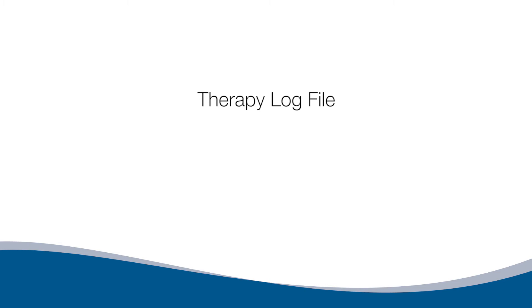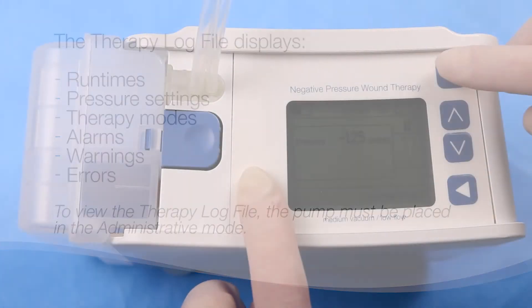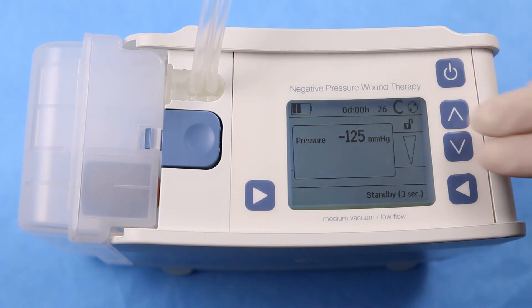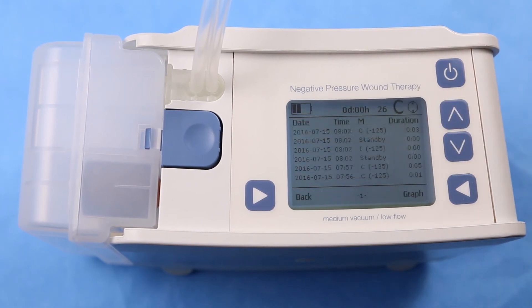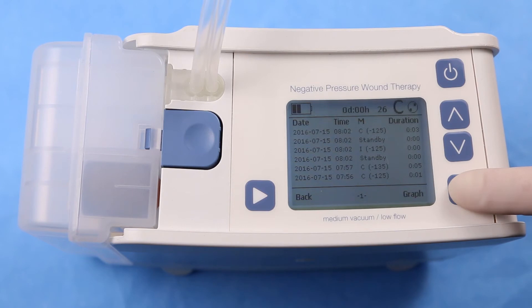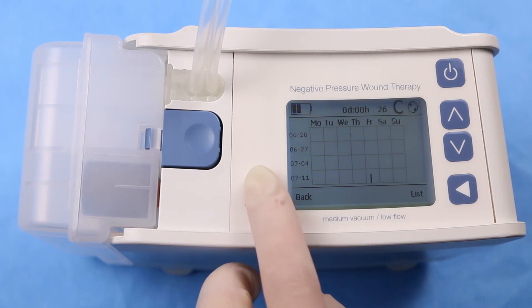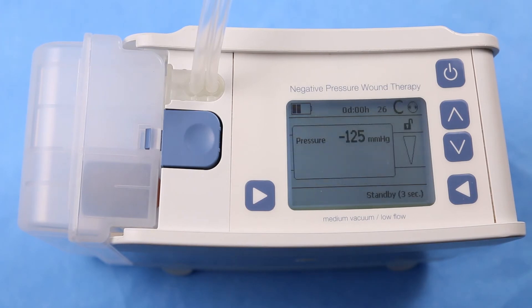Therapy Log File. The Therapy Log File displays run times, pressure settings, therapy modes, alarms, warnings, and errors. To view the log, the pump must be in Administrative Mode. Press and hold the bottom left button and then press the top right button, then press the up and down arrow buttons at the same time. The last 51 events are logged and displayed. To view the log in graph format, press the graph button. To exit the Therapy Log File, press the back button.